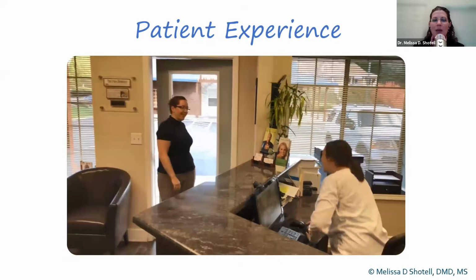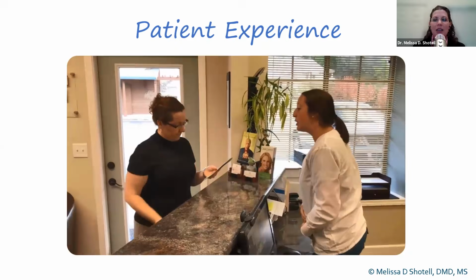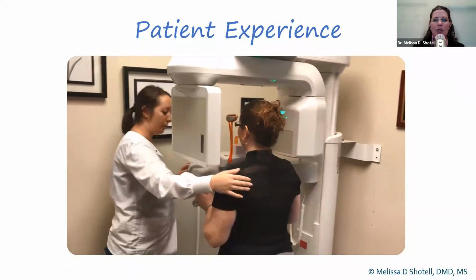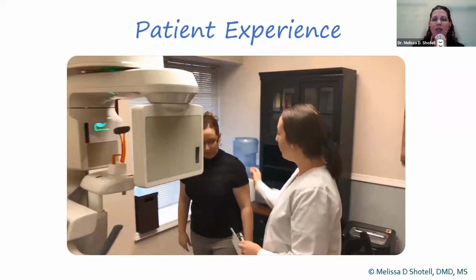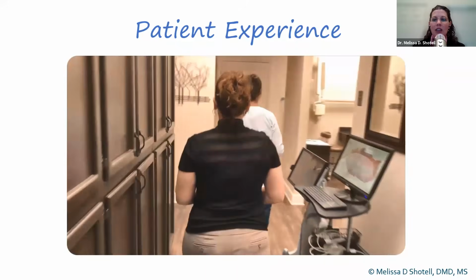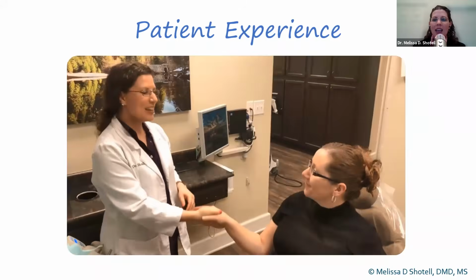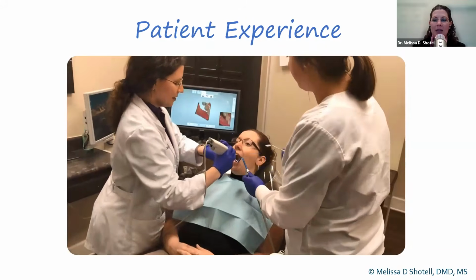So, welcome to my practice. In my office, I have lots of brochures available on clear aligners. You can customize these for your office or utilize some of those that are commercially available. And in my practice, we have what I like to think of as a seamless visit for clear aligners. The patient comes in and they're given the information. We take their cone beam and I step into the operatory to take my intraoral scan.